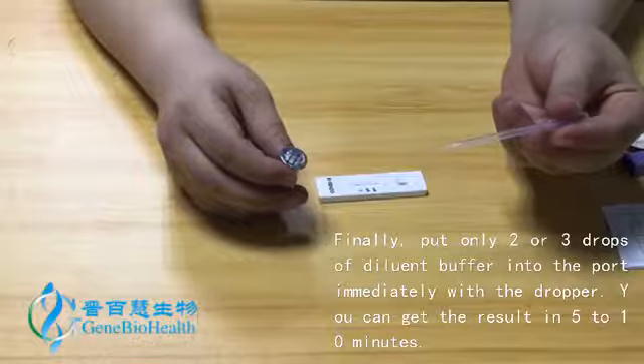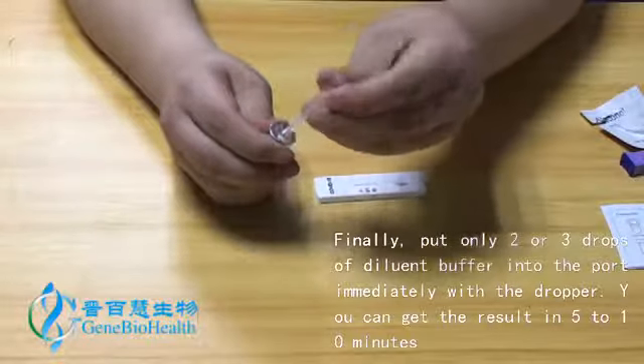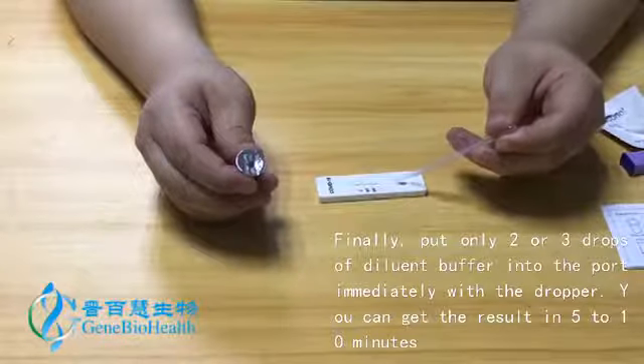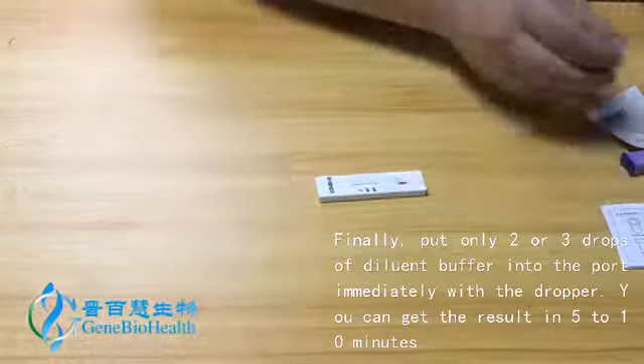Finally, put only 2 or 3 drops of diluent buffer into the port immediately with the dropper. You can get the result in 5 to 10 minutes.